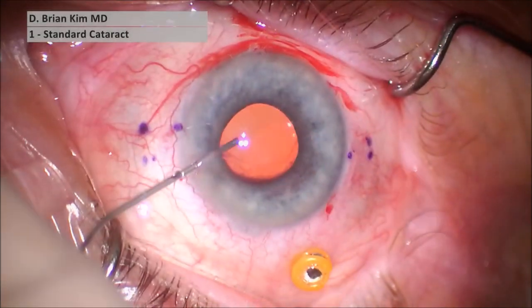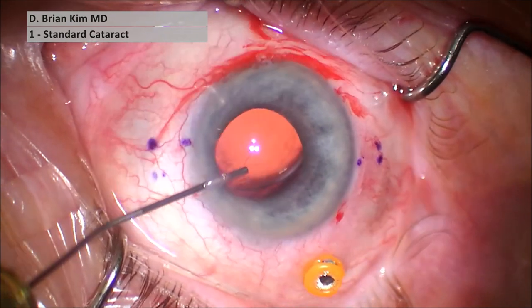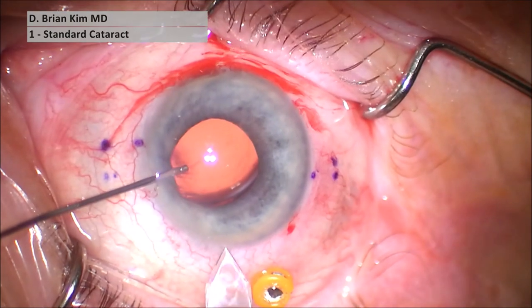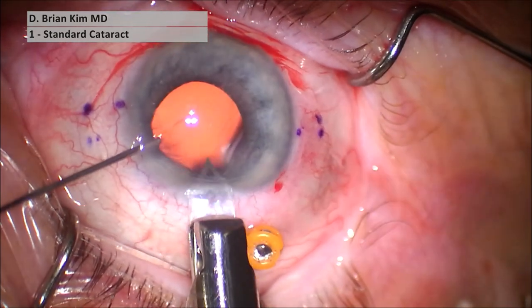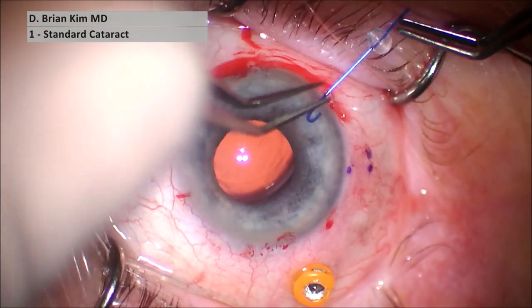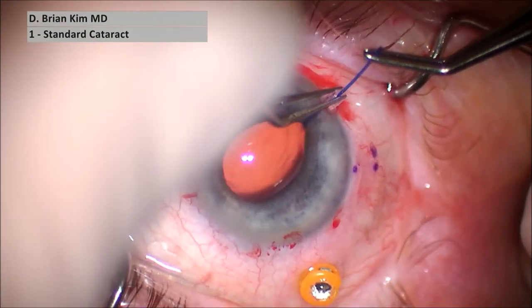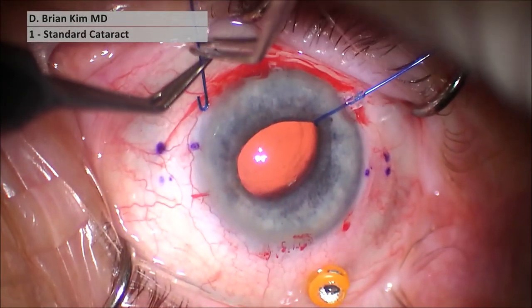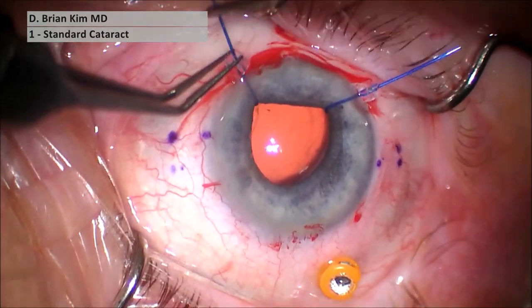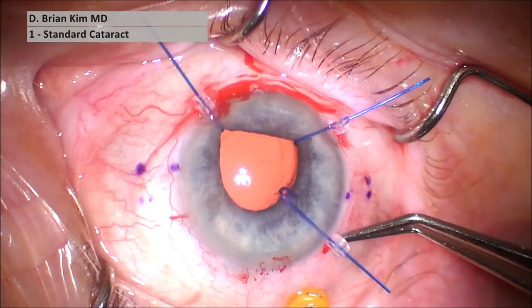I'm injecting some dispersive viscoelastic to fill the anterior chamber. This is a three-millimeter keratome blade that I'm going to use to place the new IOL and to explant the lens. I'm placing the iris hooks — this is easy to do. You grasp it, rotate the hook facing down, and then cinch the stopper down. You just twirl the stopper so you can get the hook facing down and then cinch it. With practice, these hooks are really not that difficult.